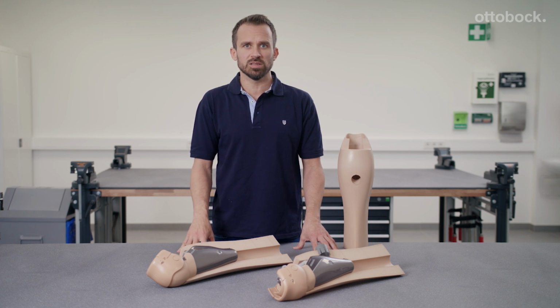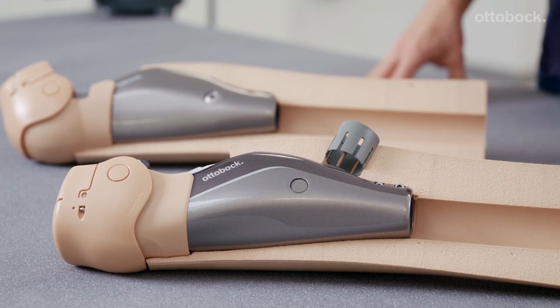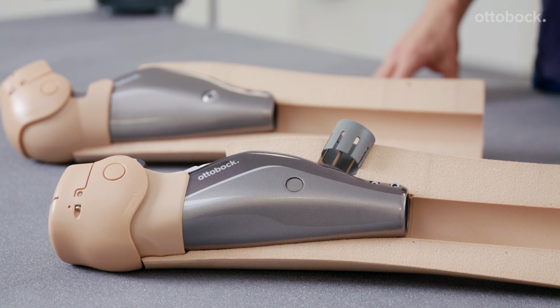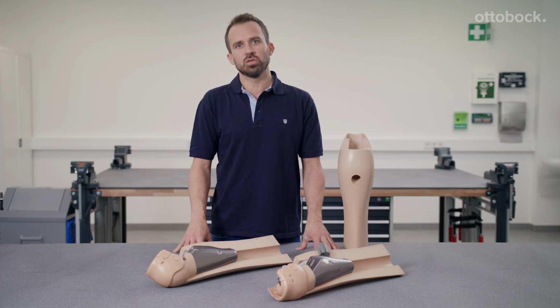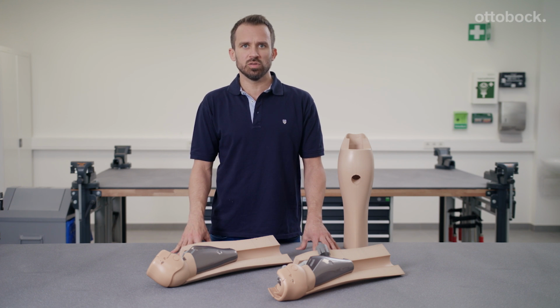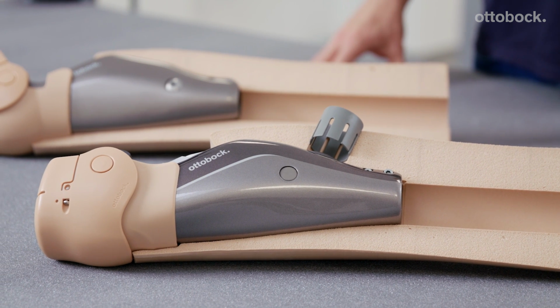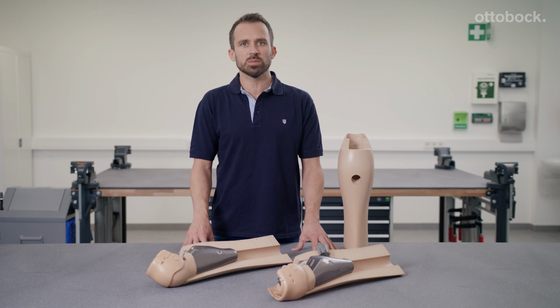For smaller ankle sizes, it may be necessary to make the diameter of the tube a bit larger. My recommendation: cut a piece of Pedalon or Plastazote to a thickness of 5 mm, a width of 122 mm and the same length as the tube. Use double-sided adhesive tape to affix it to the tube. And now you have a diameter that is a bit bigger and offers greater stability. The shank is now shortened according to the user's measurements and taking into account a compression measurement of 1.5 cm and the foot position.